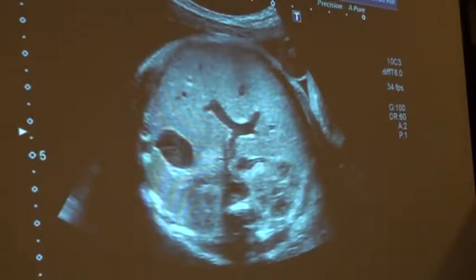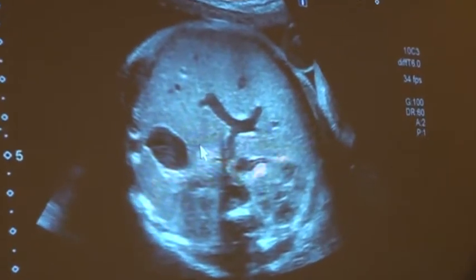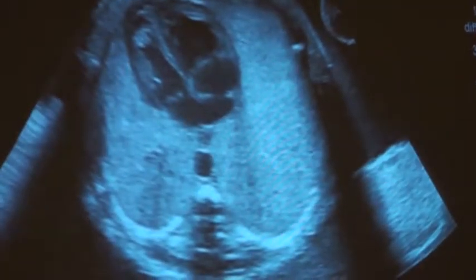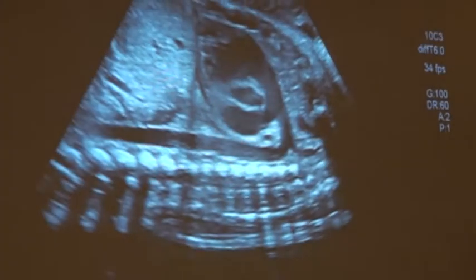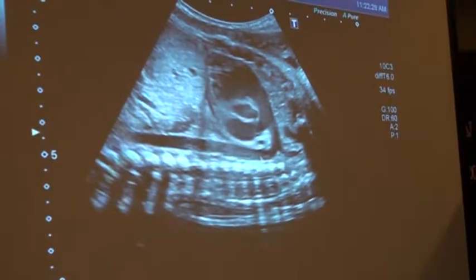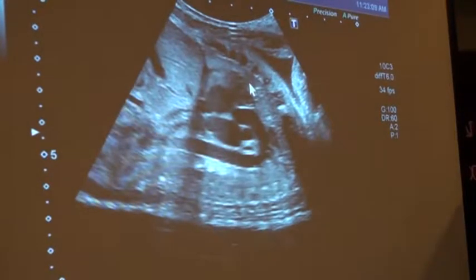The key start point is that you first take the transverse of the body with the aorta, with the J-shaped configuration, and the stomach, and then do the pivoting of the probe to get the four-chamber view of the heart. I'll not teach that because he gave a beautiful lecture yesterday. And that's a ductal arch. So that's the aorta and the open hand hockey sign, ductal arch. And that's the closed, that's the Pakistani hockey sign.